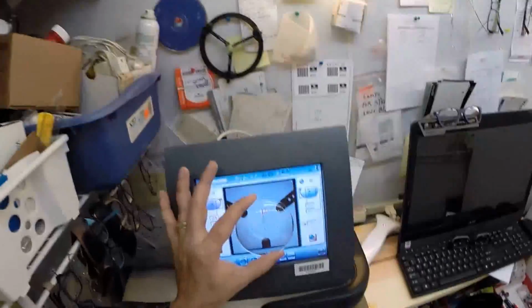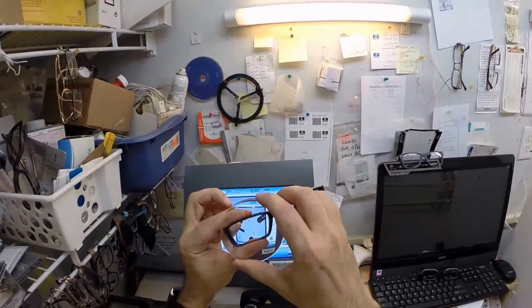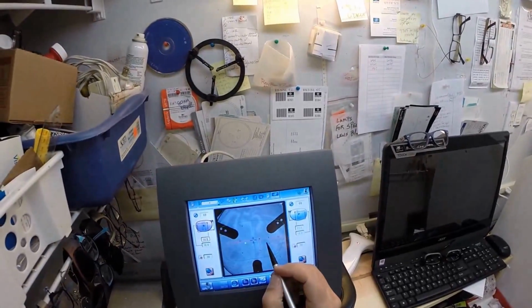So again, the reason why I put those red dots on there is that your lens has to go in there just perfectly. It cannot be rotated. And this dot in the center is your optical center. That's going to sit directly over your pupil.